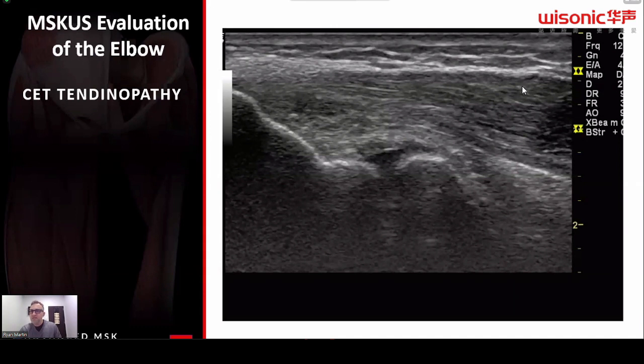And what you see is these muscular fibers turning into tendons. So this is the myotendinous junction. You can see those fibers. They look like guitar strings. They look like these sinuated fibers that come down in here, parallel in line here. And then as they get more and more towards that attachment site on the humerus here, you'll see that you lose the texture. It gets much, much thicker. And you have these small hypoechoic spaces in here. Now remember, hypo, dark, hyper, bright.